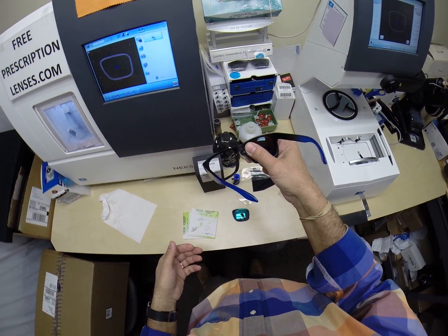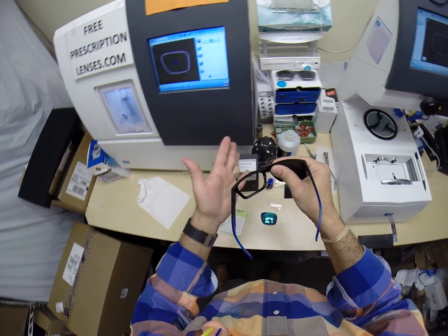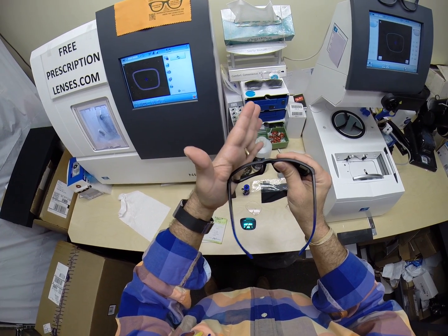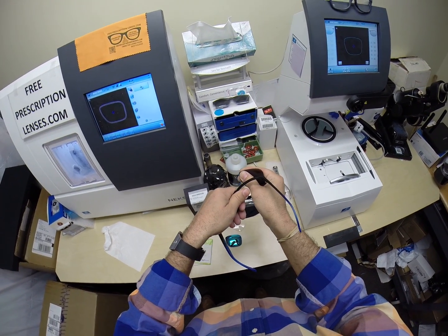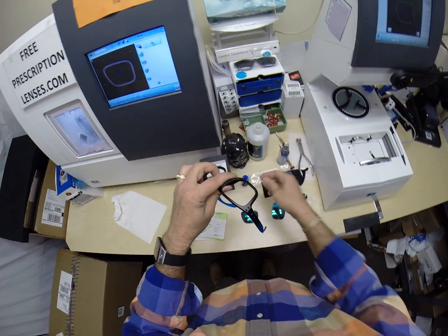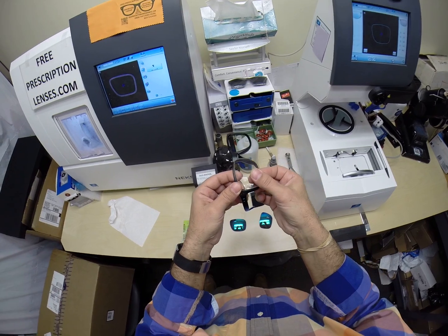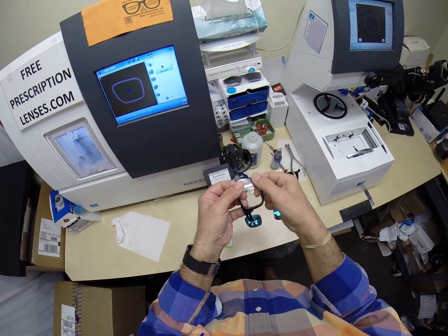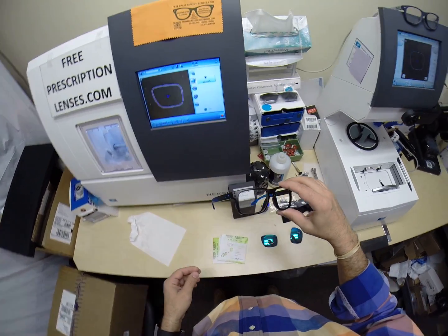Again, to pop out the original lenses, you turn this over. I'm right-handed. Left-handed people do just the opposite. I take my right thumb at the nose, grab it with my fingers on the other side, give it a little bit of a curvature, push down on the outer edge, and with my other thumb on top, just push down. It comes out rather easily. Again, to put the lens in, you turn the frame upright, elbows at my sides, tuck the lens in at the outside corner, and then just push down like that. It snaps right in. That's how you do it with plastic frames.